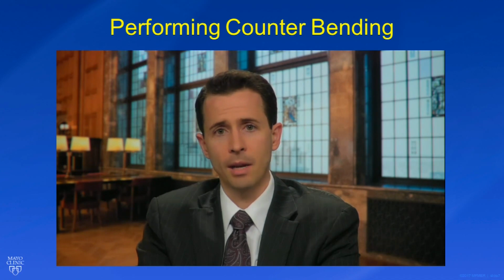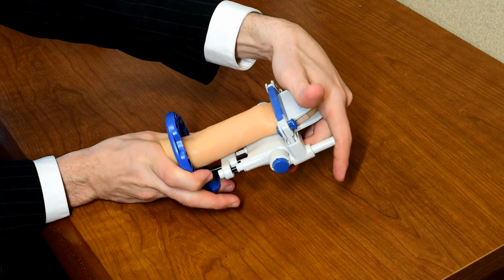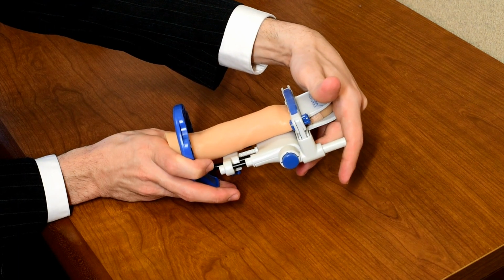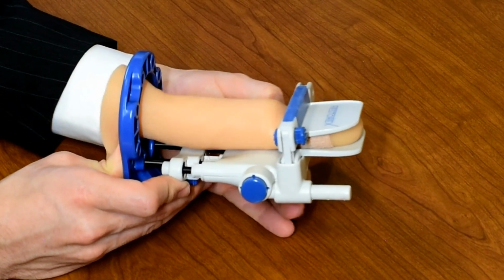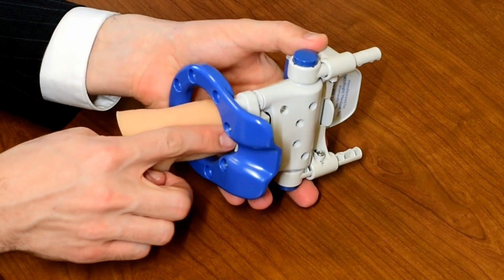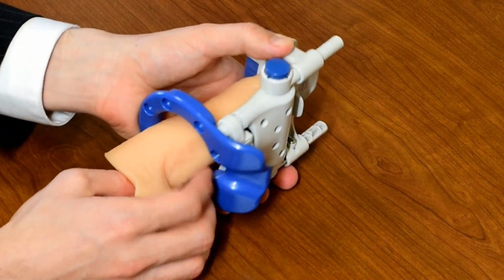One way to make counterbending easier is to start off a stretching session in the straight position for 15 minutes before counterbending. This will loosen up the penis and often will provide additional length for the counterbending. Before starting the counterbending, it's also helpful to release all of the traction on the penis. This is done by sliding the release button to bring the unit back to the body. Be really careful doing this so as to not accidentally pinch the penile or scrotal skin in this area.